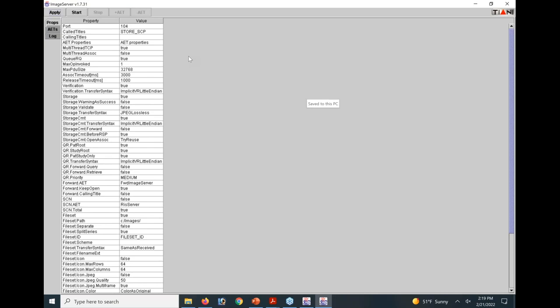Called. It's like a phone conversation. If I'm calling you, you are being called. The SCP is the service class provider. The SCU is the one doing the calling. So I'm going to leave calling blank because I want to be promiscuous in this case and allow any SCU to communicate. Why am I not setting an IP address in here?